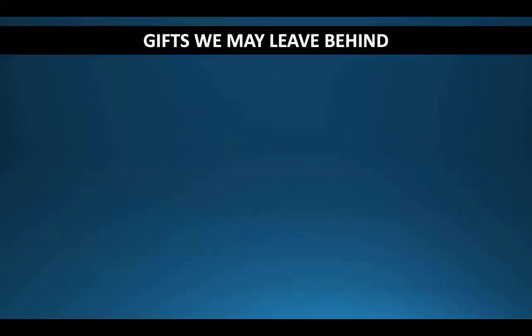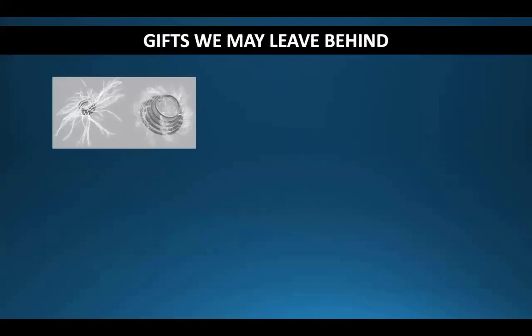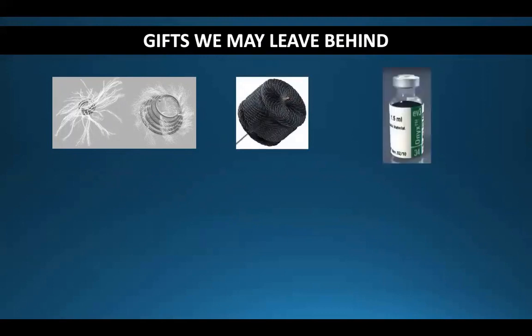Gifts we may leave behind in your patient. So these are fibered coils. There are also unfibered coils, which we use often. That's an Amplatzer plug, and a liquid embolic agent, in this case Onyx.